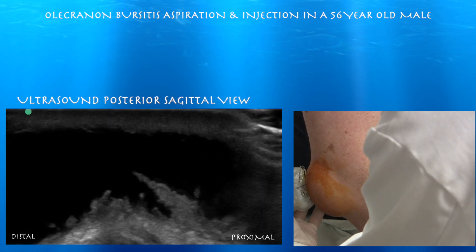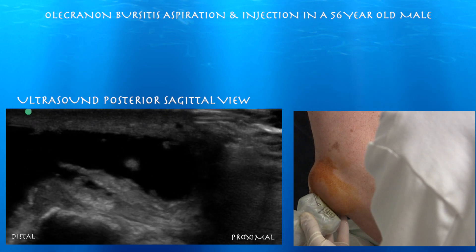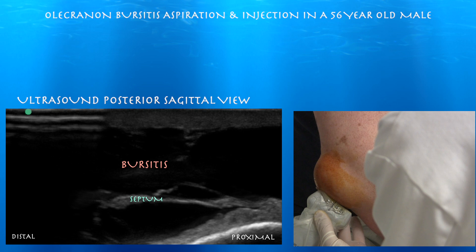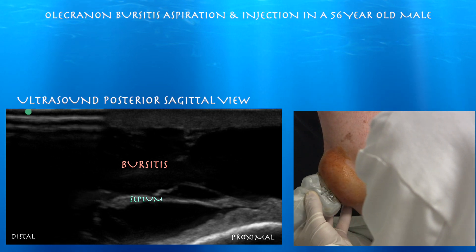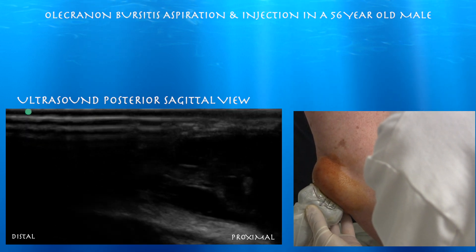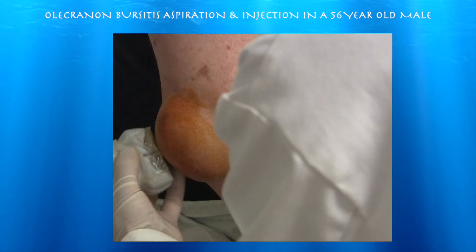Huge olecranon bursitis. Right side of the screen is proximal. You can see a little septum in here as well. Ultrasound can help you if this is really divided into different compartments — then you can kind of breach these septa. You can breach it now and then drain the whole thing.